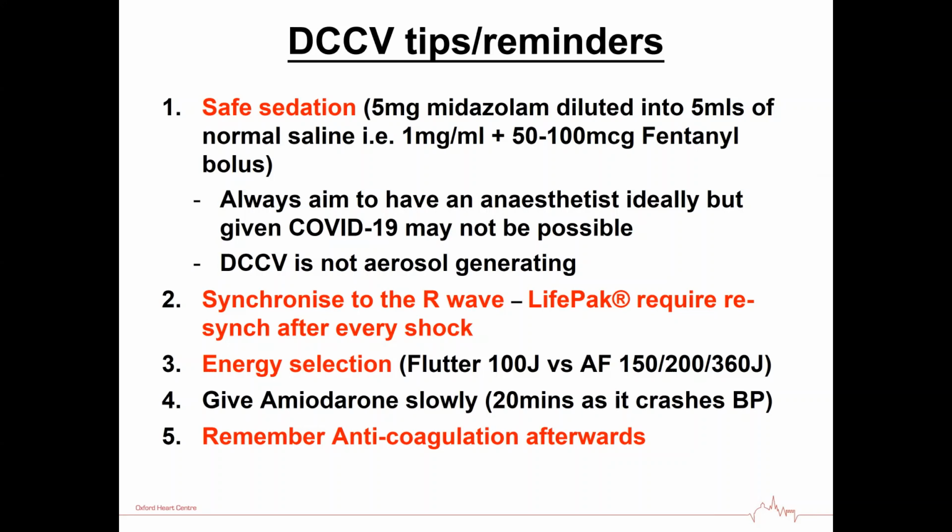Cardioversion is not aerosol generating. Remember to synchronize to the R wave, as I just said, and energy selection. So flutter requires a lower energy, so you can start at 100 joules. You only want to give the patient one shock, so there's no point trying to be a hero and go even lower. I know it often will work, but go at 100 and it'll work.